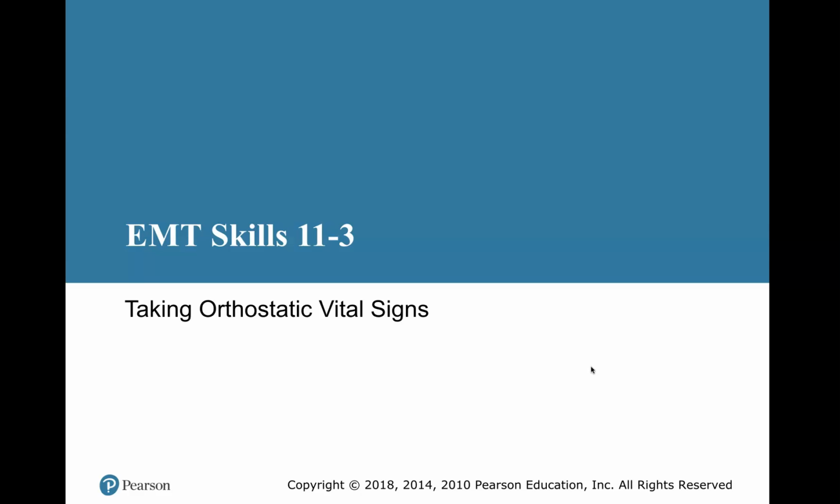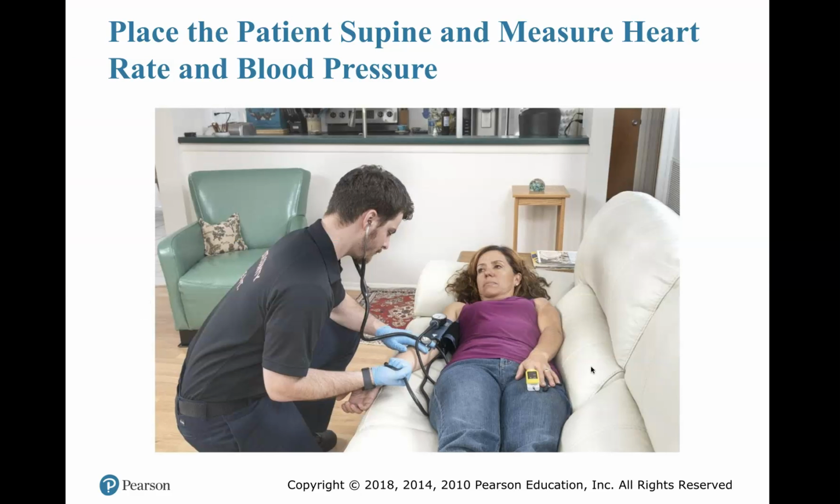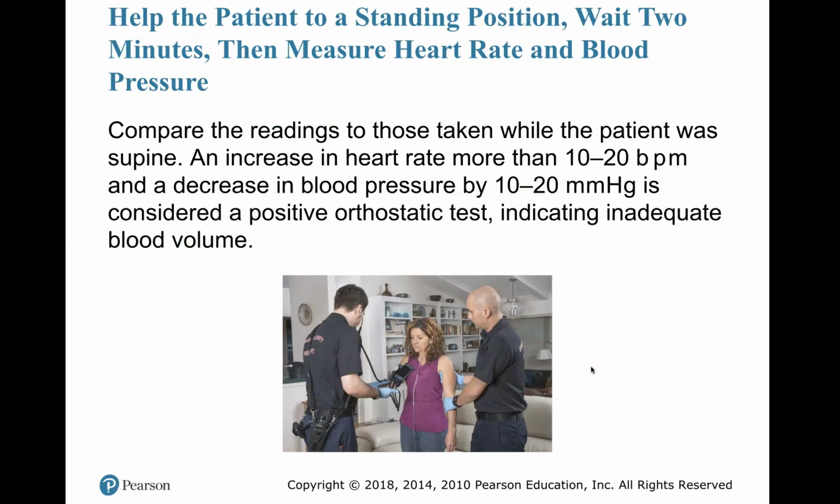Here's orthostatic. Getting that heart rate and blood pressure while they are laying in the supine. Have them stand, wait 2 minutes, and then see if the heart rate increases and the blood pressure decreases, indicating inadequate blood volume or fluid volume.